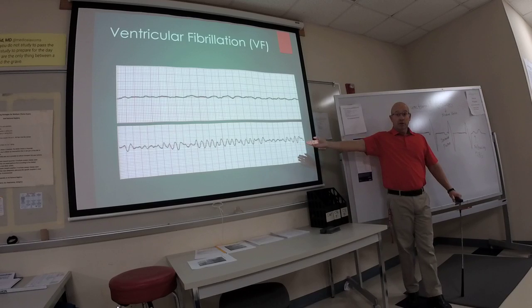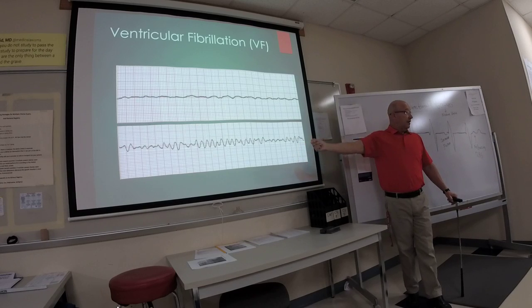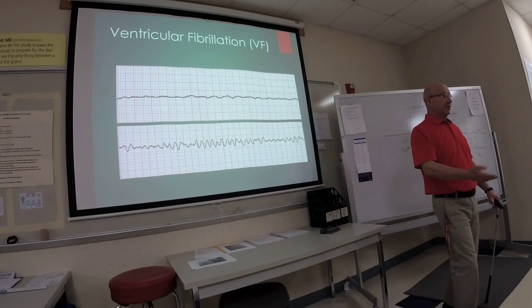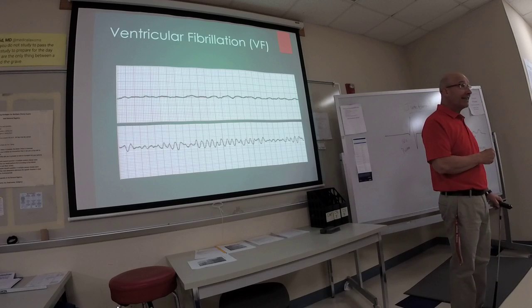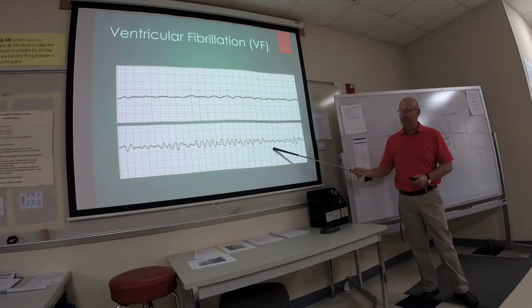Code blue. Press the blue button. You would call a code. This is V-fib. This is lethal. Okay? Definitely, you wouldn't calmly walk down to the nurse's station and go, hey, by the way, I think Mr. Smith in 205's in V-fib. They'd be going, what? So, call a code.